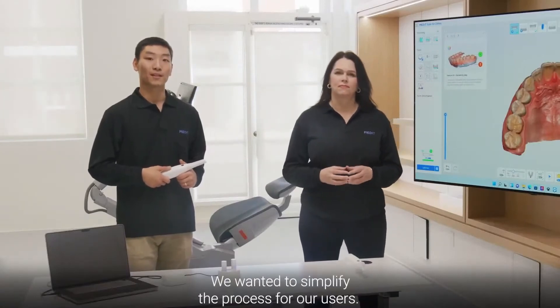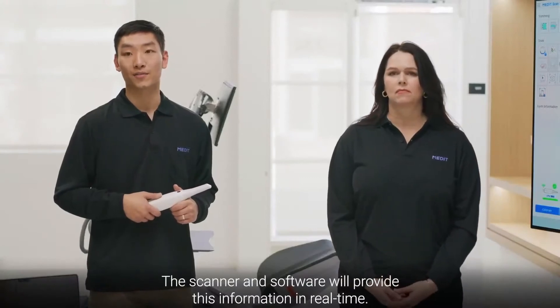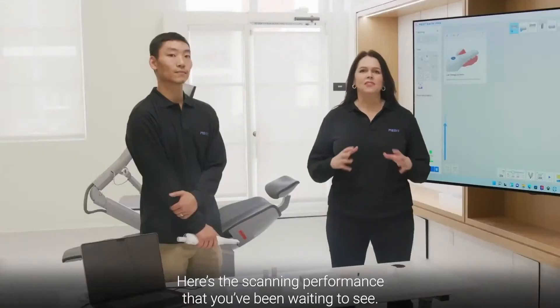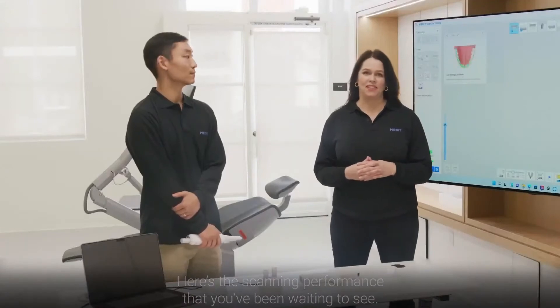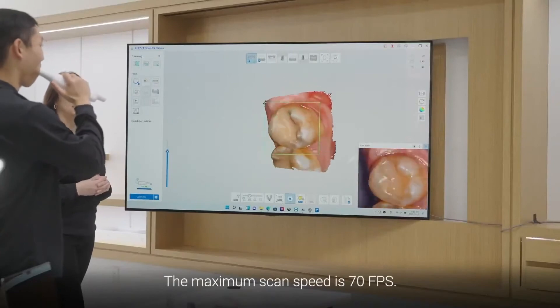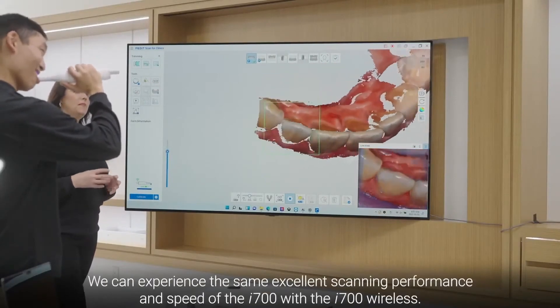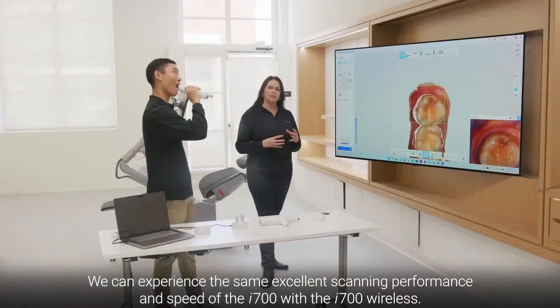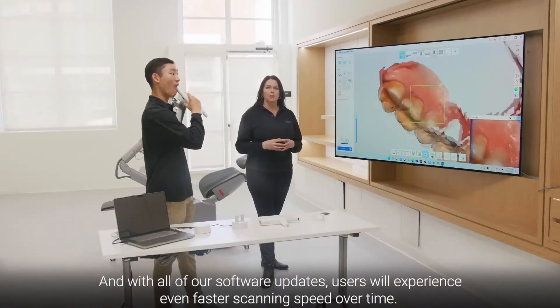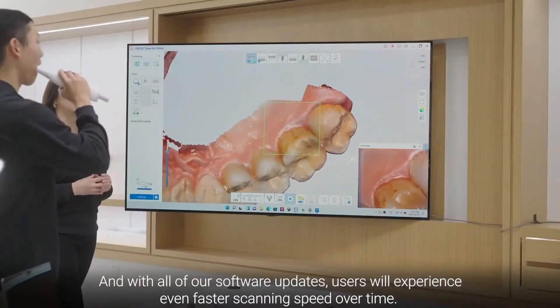We wanted to simplify the process for our users — the scanner and software provide this information in real time. Now let's try scanning. The maximum scan speed is 70 frames per second. Users can experience the same excellent scanning performance and speed of the i700 with the i700 Wireless, and with ongoing software updates, users will experience even faster scanning speed over time.